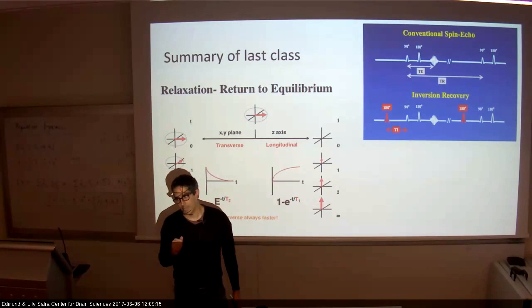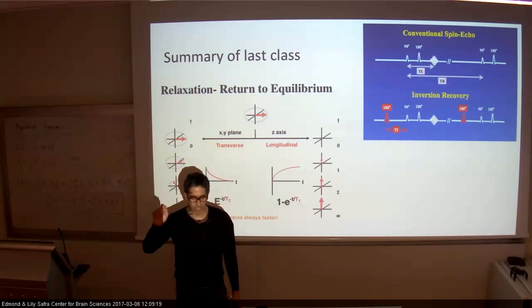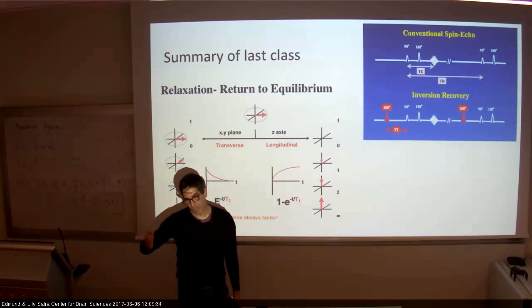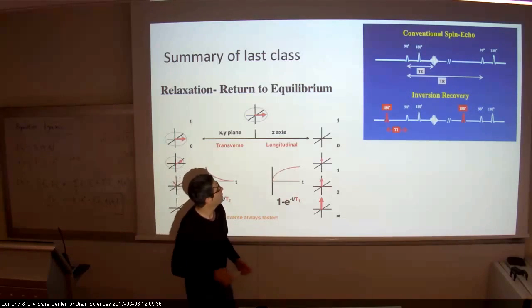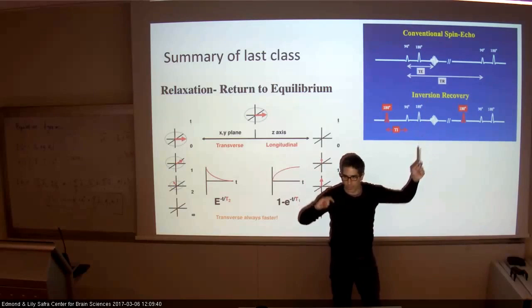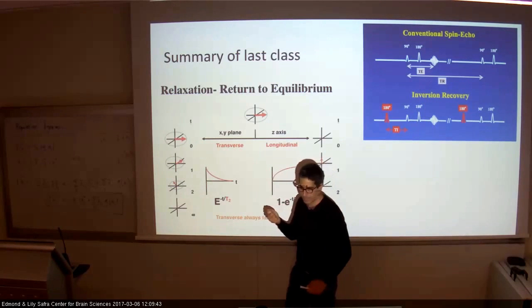Maybe I'm not certain, but this echo will essentially give us a moment in which we can measure some time later after this sequence of pulses, which is important for us. When I'm rephasing them, there will be a moment half of a TE afterwards in which I can actually measure. Suddenly there will be a signal that I can actually grab.